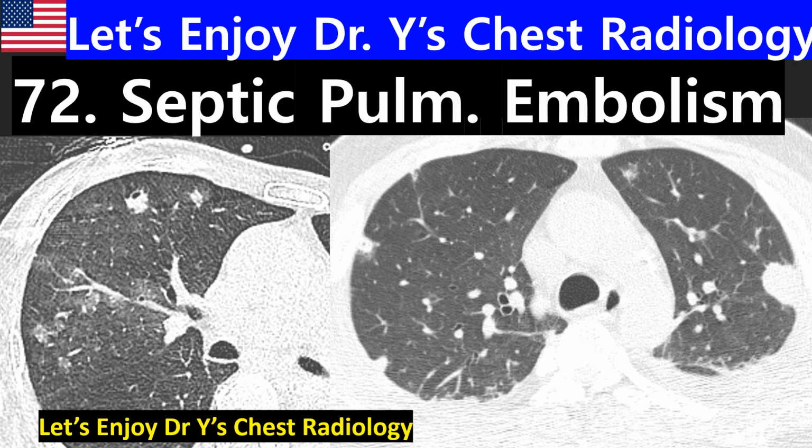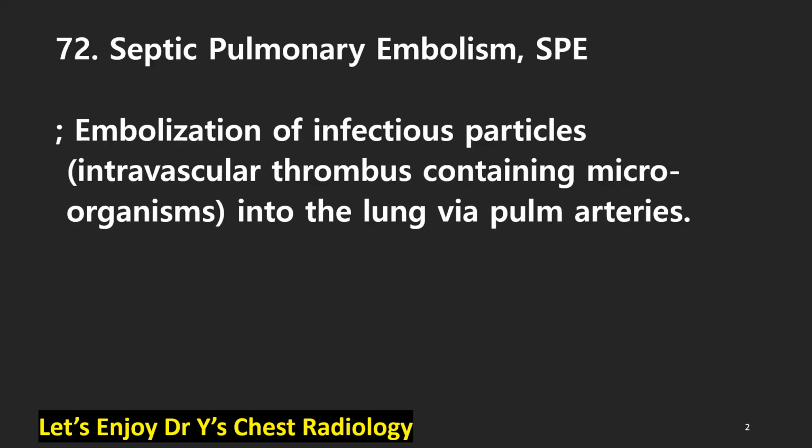Let's go. Septic pulmonary embolism, SPE, is defined as an embolization of infectious particles, intravascular thrombus containing microorganisms, into the lung via pulmonary arteries.